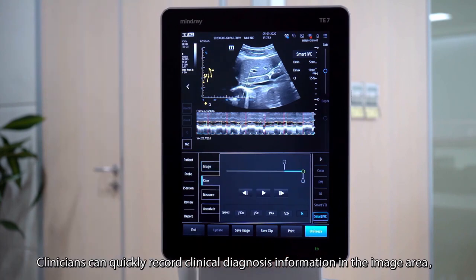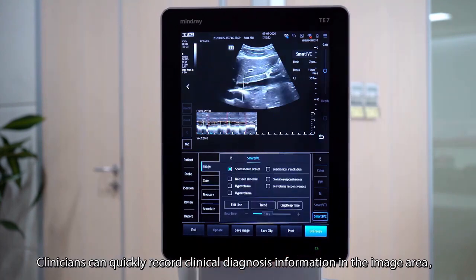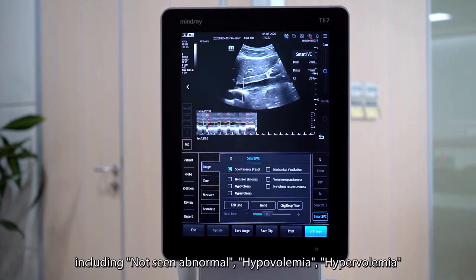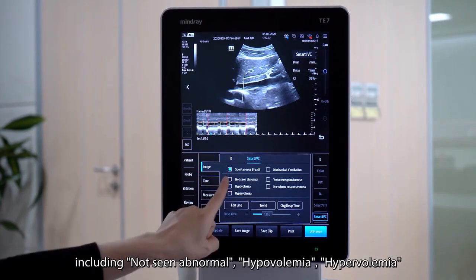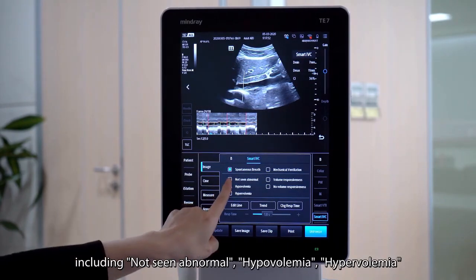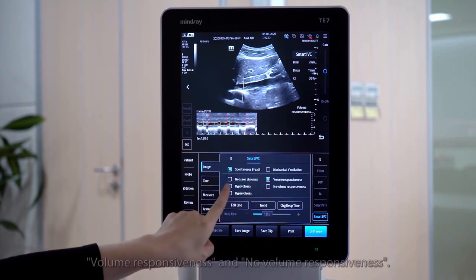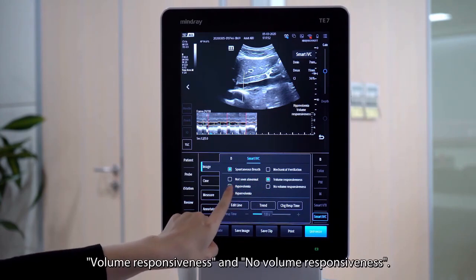Clinicians can quickly record clinical diagnosis information in the image area, including not-seen, abnormal, hypervolemia, hypovolemia, volume responsiveness, and non-volume responsiveness.